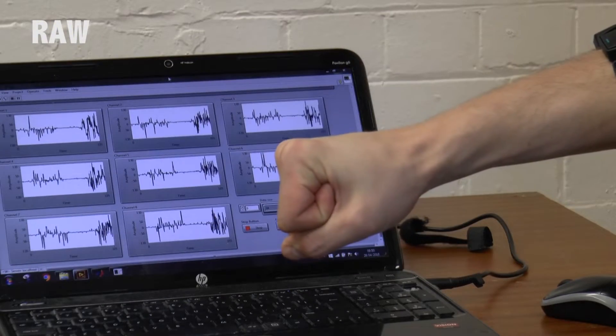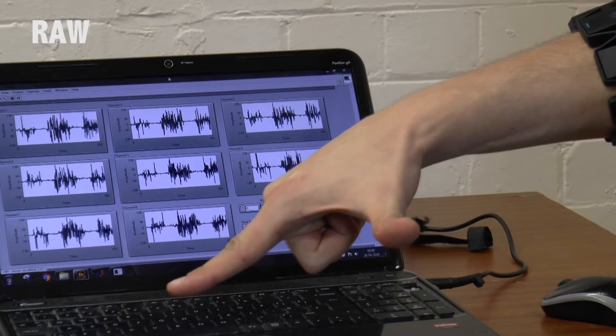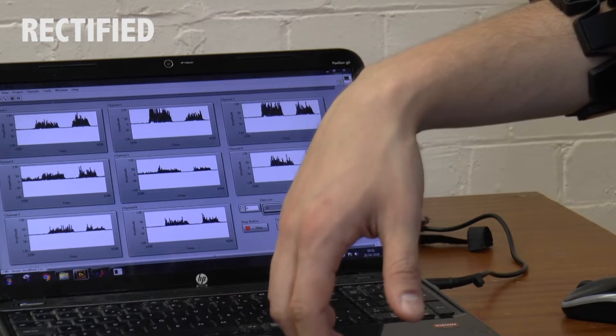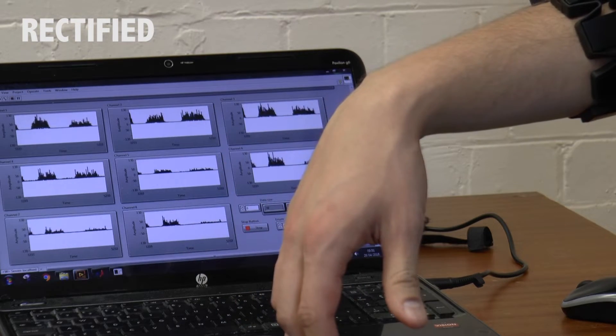Okay then, what about classification? Well, when you perform some kind of action involving your muscles, different muscle groups are being activated depending on what you're doing. And if you look closely at the live acquisition of EMG data, you can start to recognize patterns in the signals that you're observing.